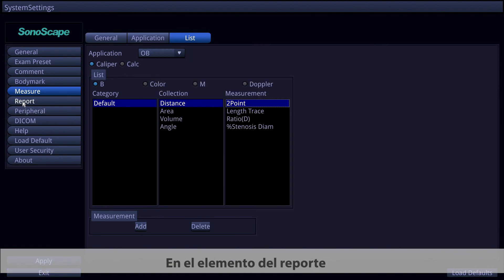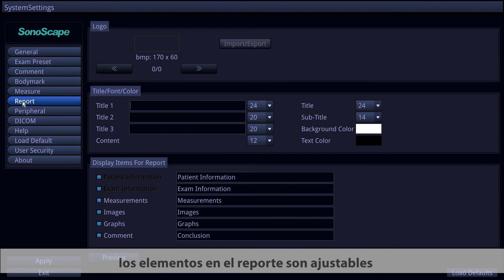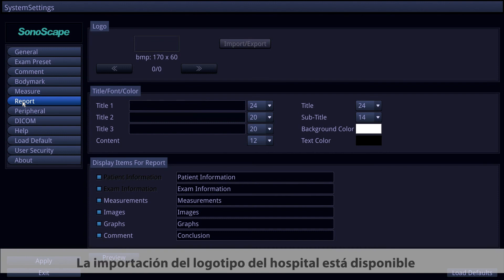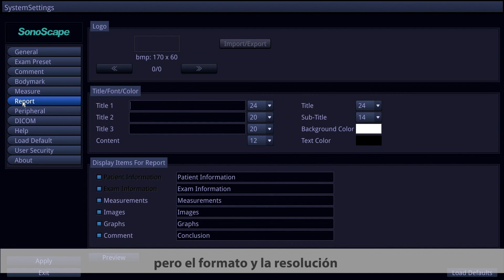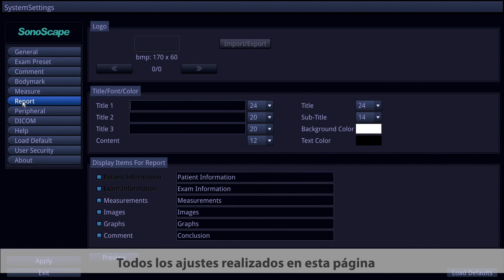Under the Report item, the elements on the report are adjustable. Hospital logo importing is available, but the format and resolution must strictly follow the instruction. All adjustments made on this page will be shown directly on the report.